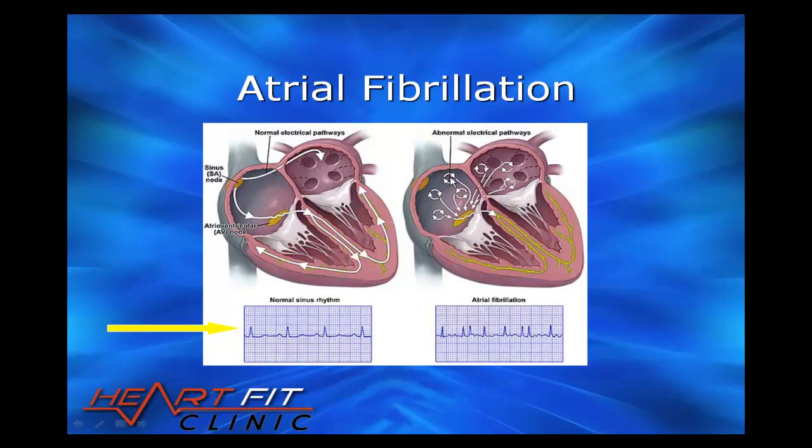And you can see here that the signal goes down the ventricle, but it is not as strong as it should be, resulting in reduced contraction times. As you can see, it then results in an irregular heart rhythm below. You can see the QRS complex is not regular, and the P wave is actually notchy, or it's chaotic.